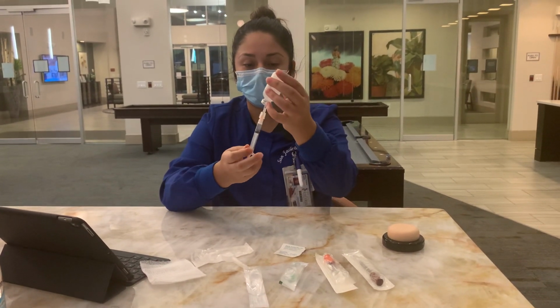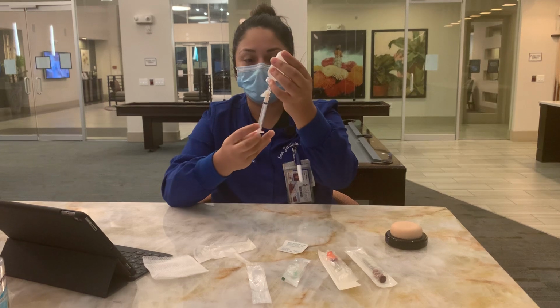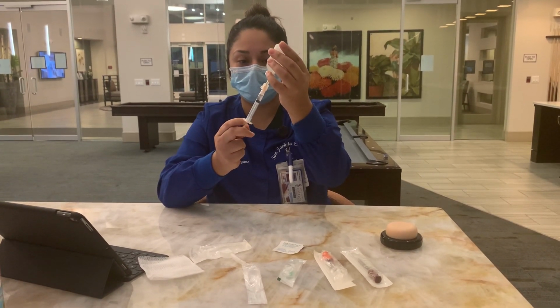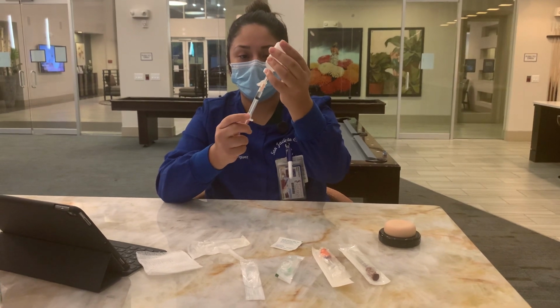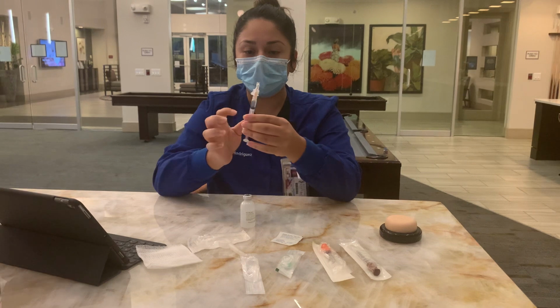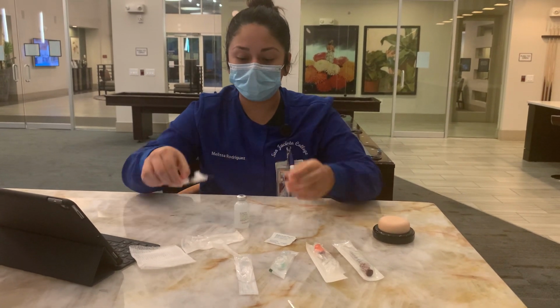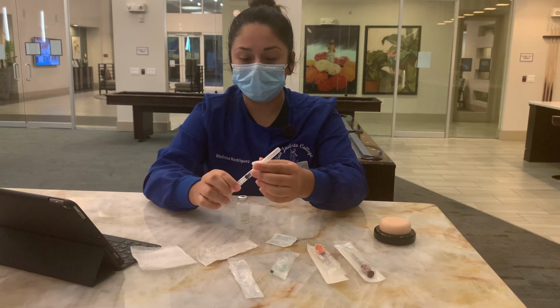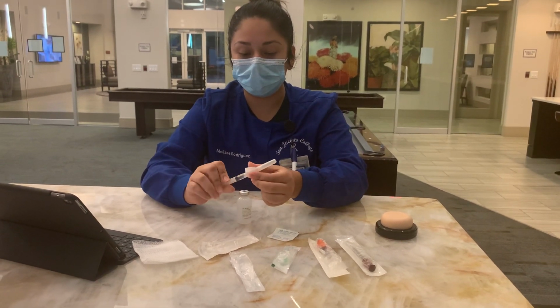Flip it over, push the air in, and remove 1 ml. Once I've done that, I'm gonna make sure I don't have any air bubbles, recap my needle, and I am going to switch needles.